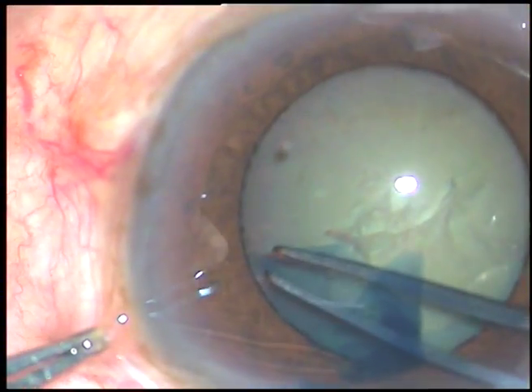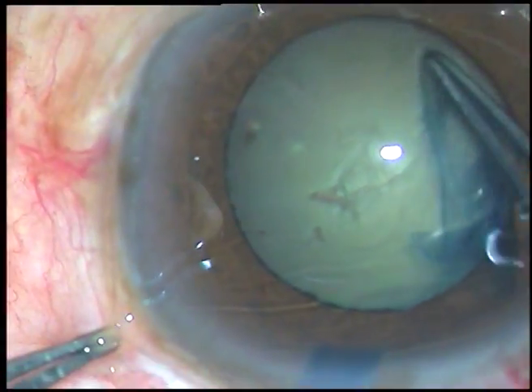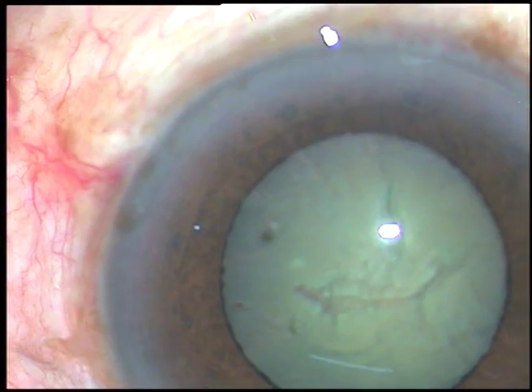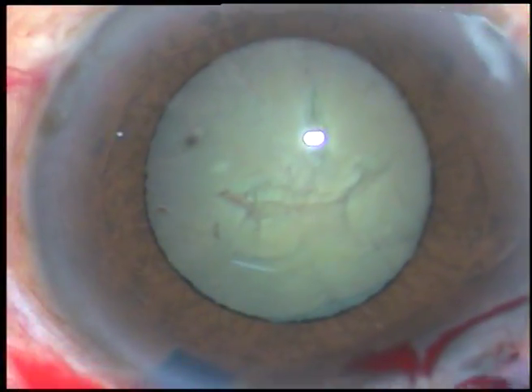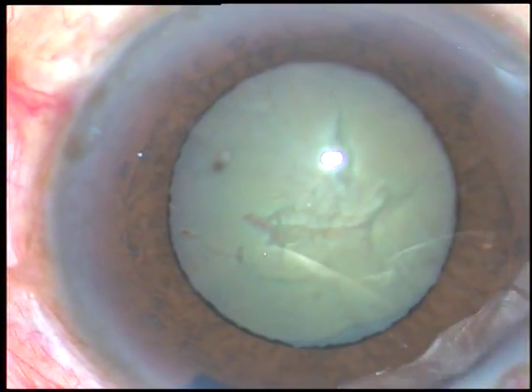The pupil has dilated to almost 5 mm, or say 5.25 mm, and the rhexis size is the same — 5 or 5.25 mm. Now, hydrodissection.